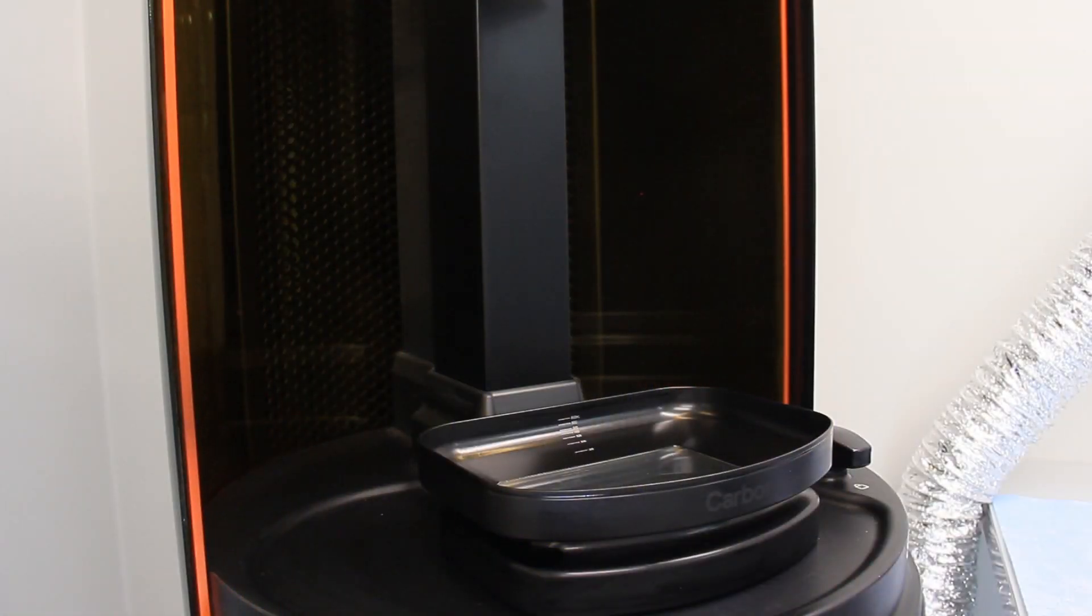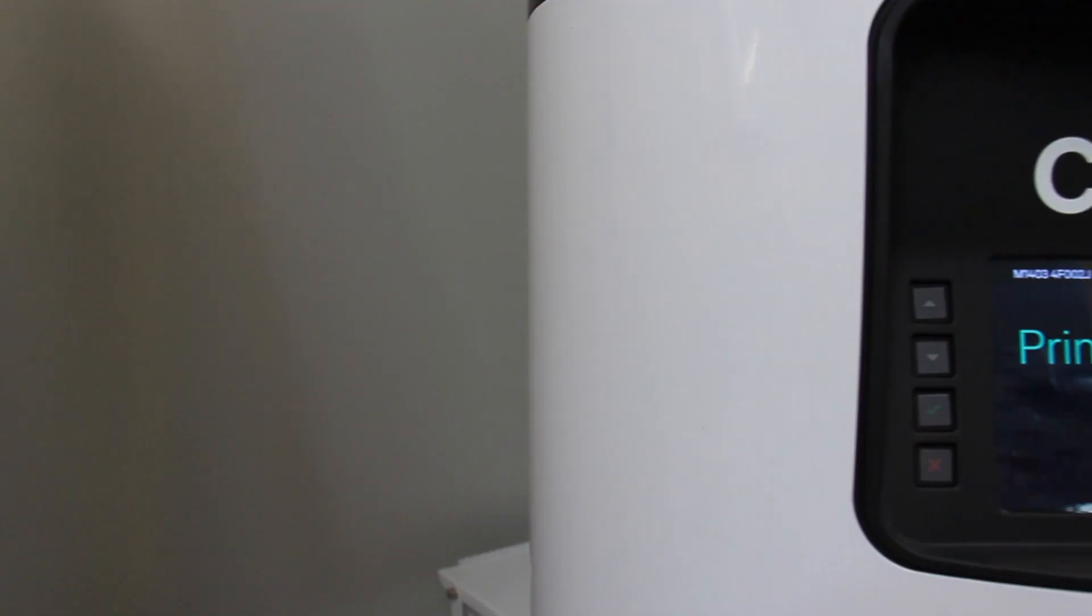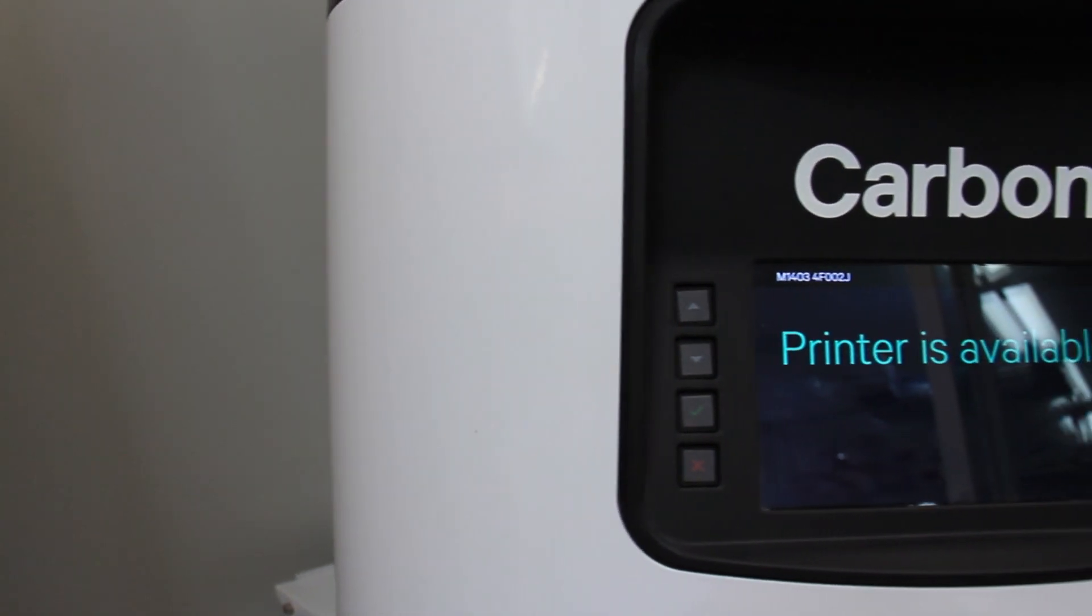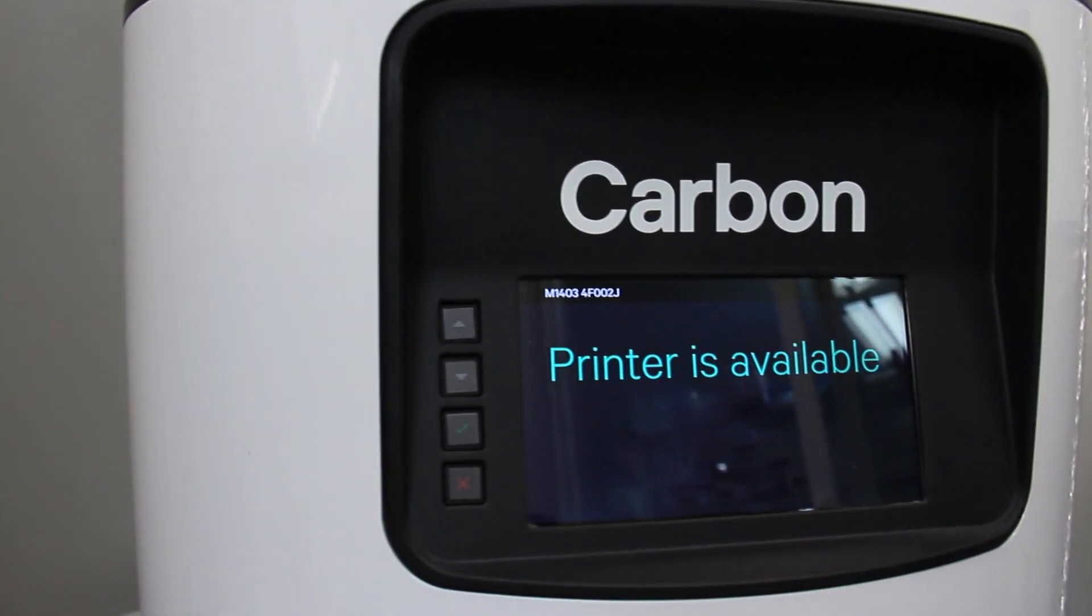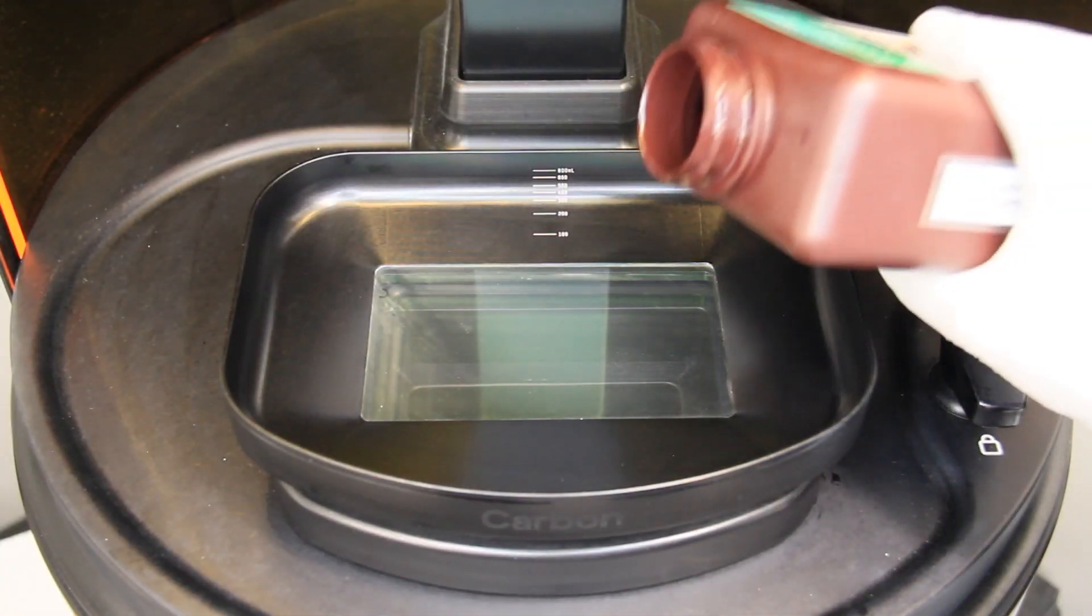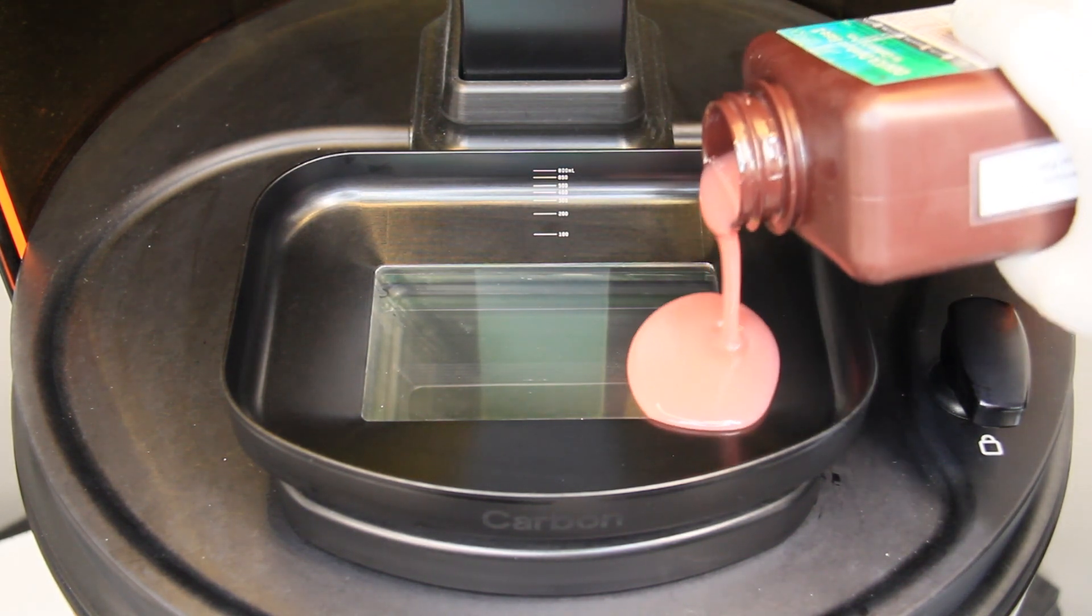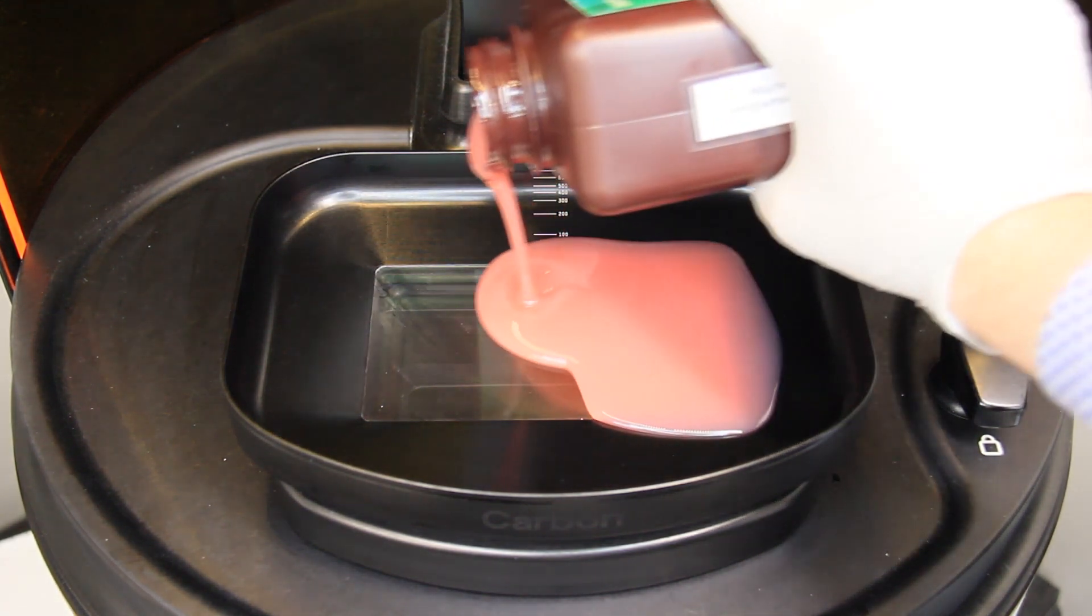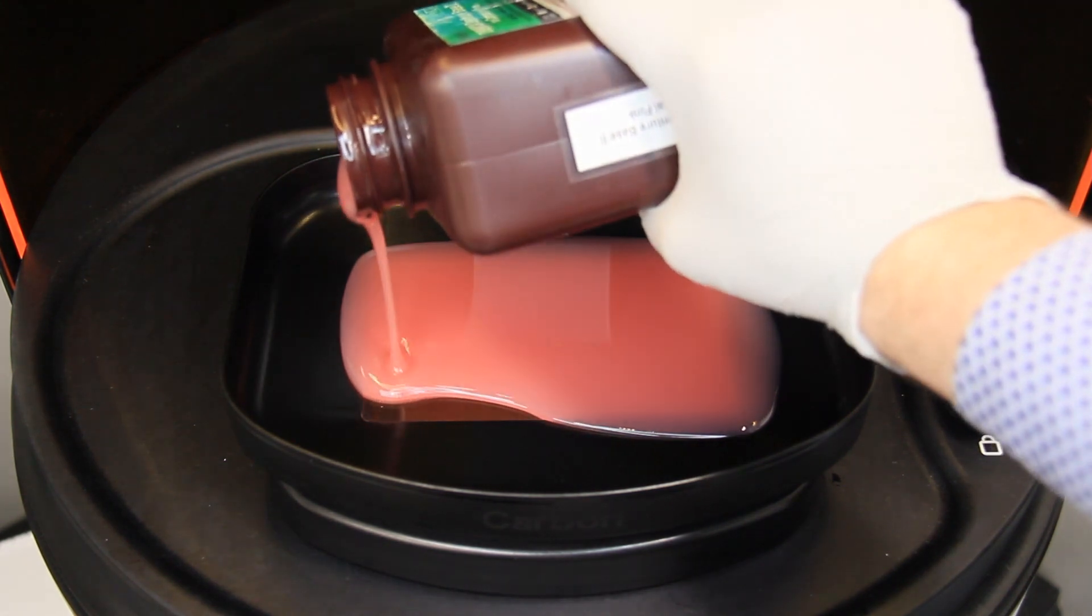The dentures are printed on a high-tech carbon 3D printer. The carbon printer uses a very precise ultraviolet projector to cure the resin exactly where desired. This is one of the only 3D printers that can reproduce the level of fine detail maintained throughout the process.